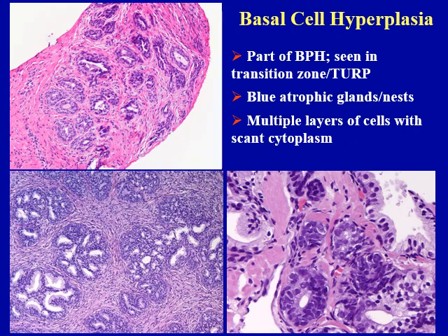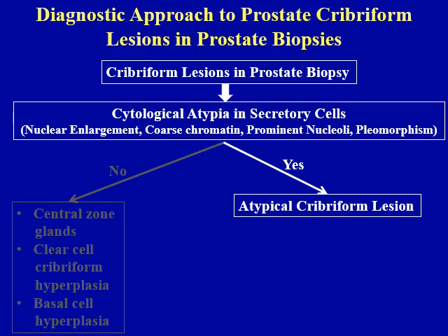Basal cell hyperplasia is also part of BPH, so it is seen in the transition zone and transurethral resection specimens. At low power, you can see this nodular proliferation of blue atrophic glands and nests. They can form several different architectural patterns, including a small glandular pattern which may be mistaken for prostate cancer, and sometimes you can also see cribriform architecture as well. At high power, the glands in basal cell hyperplasia are composed of multiple layers of cells with basal-looking or scant cytoplasm.